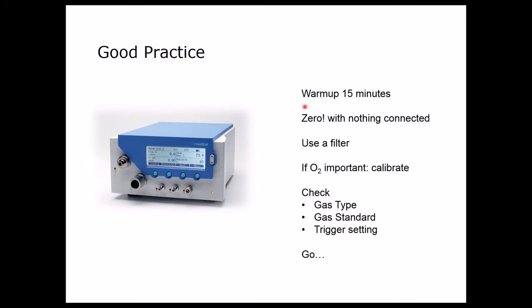Then, and this is necessary before every measurement, we have to zero the PF300 to make sure there are no offsets in any of the sensors. While you do the zero, no tubes should be connected, because otherwise you risk having some pressure applied somewhere which will then be zeroed away.